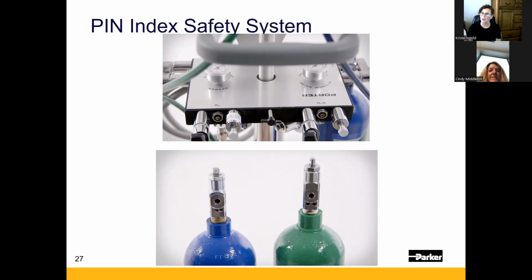And so you would peel that plastic wrap off of the new cylinder. There might be a little plastic washer. Again, you're throwing the washer away with the plastic wrap, and then you're facing your cylinder towards your washer and towards these pins. When you do this, it takes a little up and down motion. Do your best to get your pins into the pinholes and then make sure your washer is lined up with this larger hole.